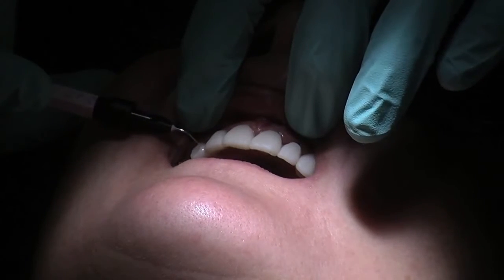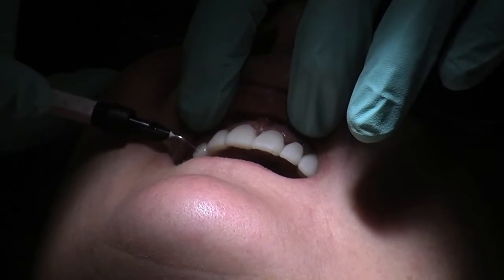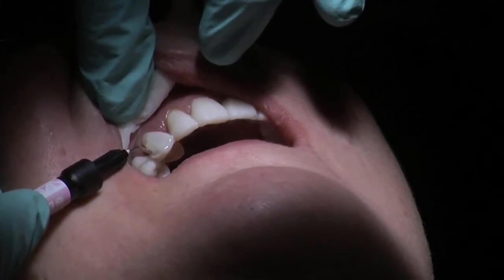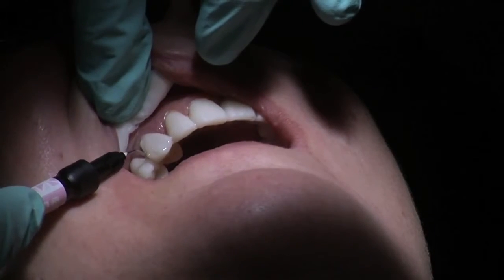You can change line angles, you can make teeth look wider, you can make them look narrower. It's all very quick and easy to do. So we're going to just build up the distal aspect of this canine now. So once again, I'm just adding the Luxaflow here. Keeping the tip in the material, just letting it flow out slowly.